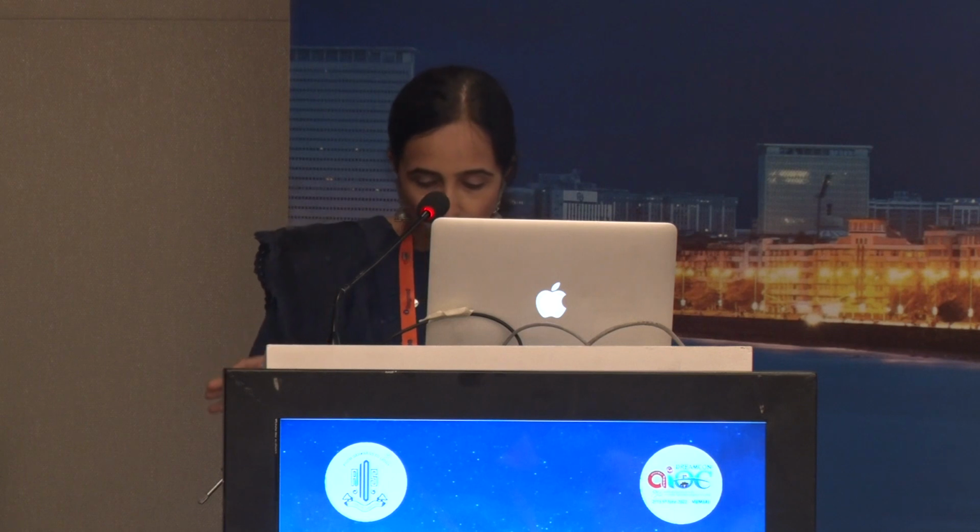So I'm enjoying this course, and I must say that we do have occasional research support grants from Alcon Laboratories, and all of us have a financial interest in torics and in multifocals, irrespective of the brand. My talk being more on multifocal and special scenarios, we need to understand, as has been discussed all through the course, that any residual refraction, particularly in a multifocal or a trifocal or an EDOF, is going to adversely impact your outcomes, and it is typically the most common reason for a dissatisfied patient.